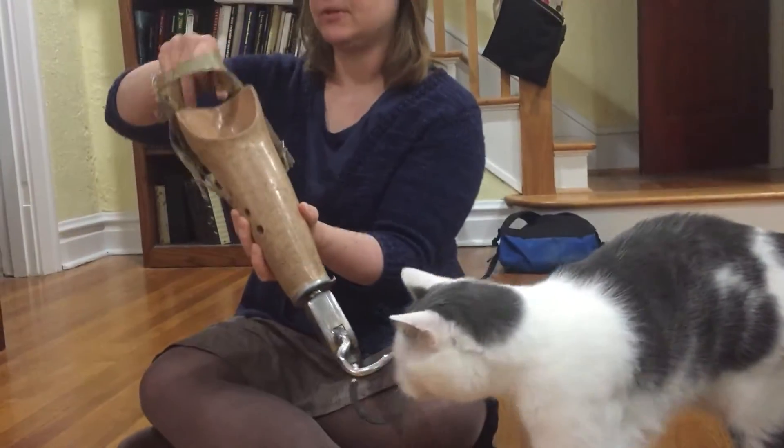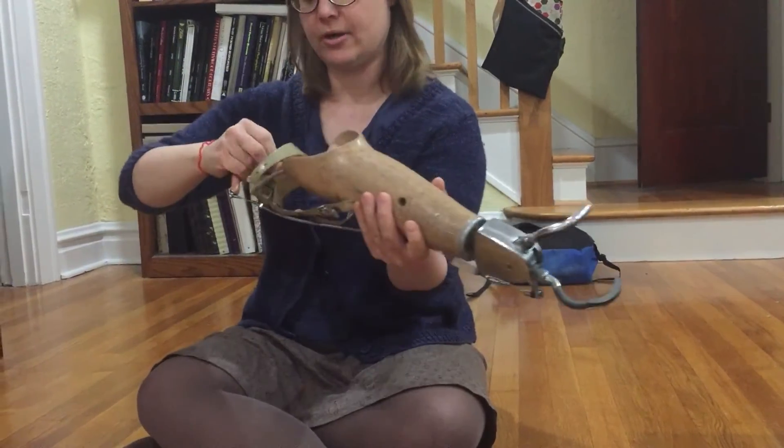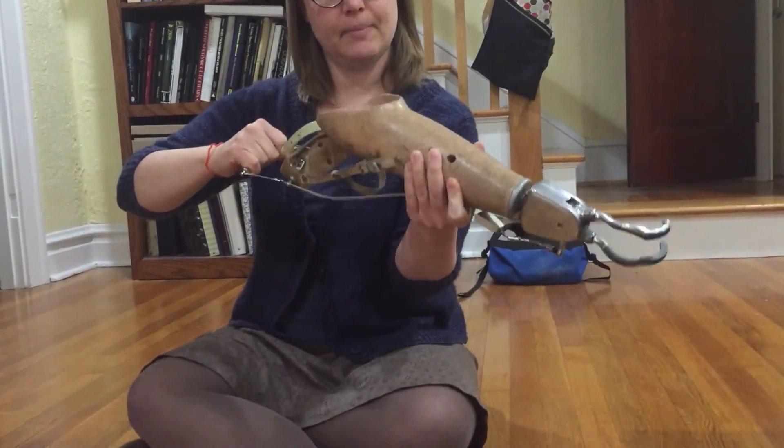This was fastened around his upper arm, but he didn't need to wear a shoulder harness because it was all operated by his bicep.